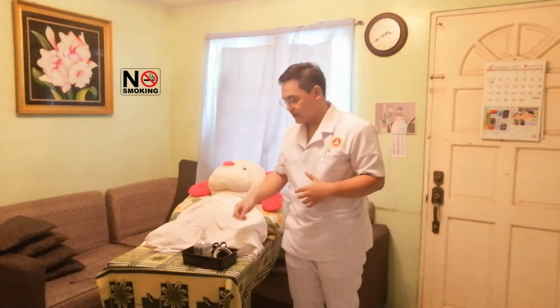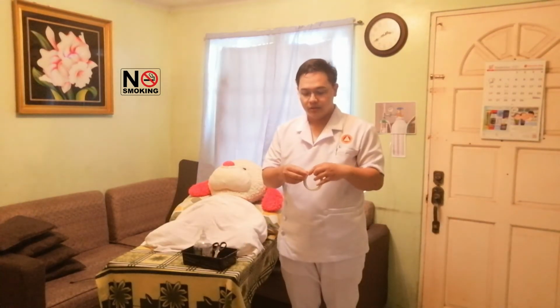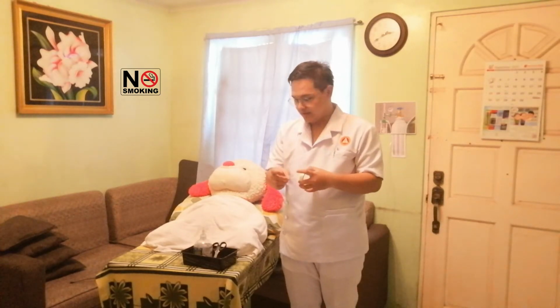So we need to make sure, or we need to take note that if our tube does not stay in place, we will now use our optional material, which is our tape, to hold it in place.